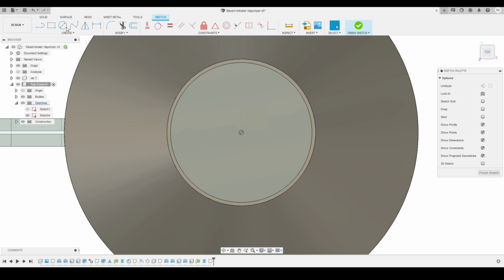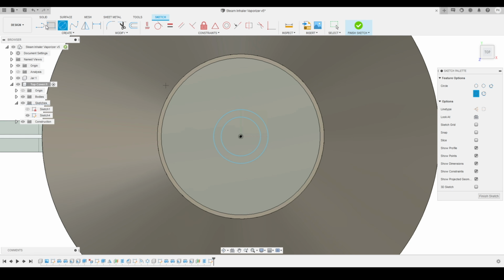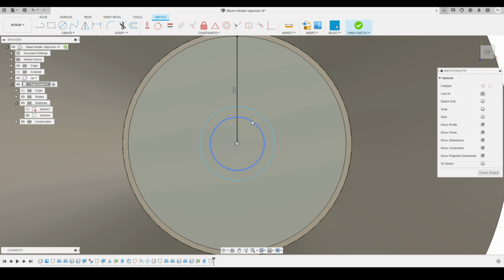I will activate my circle tool from here, and again I have to create lots of circles over here that are all 1 millimeter or 2 millimeters apart. So I'm just going to fast forward this sketch a little bit, so you can follow the same pattern and create the circles. So I have just created this dividing line, and I'm going to offset this dividing line on both sides by 0.5 millimeters.